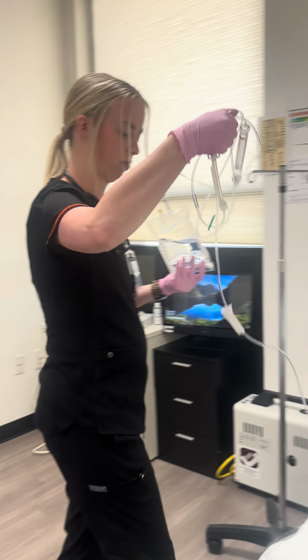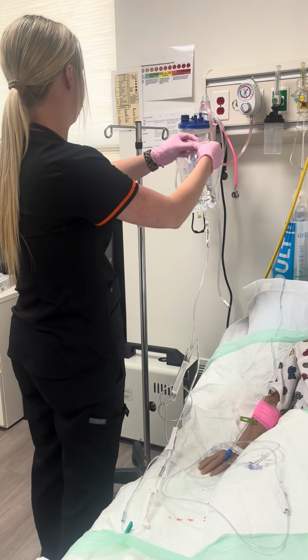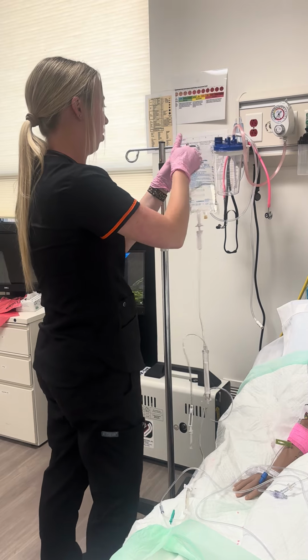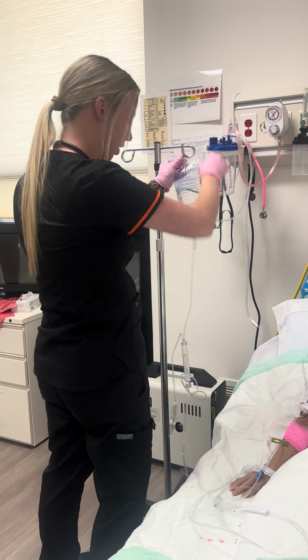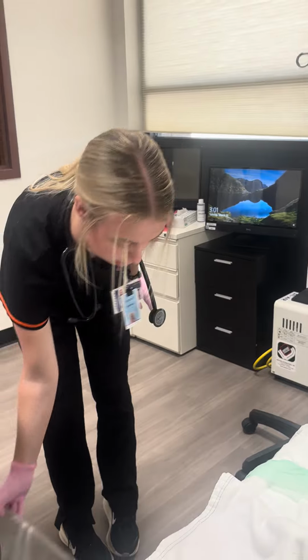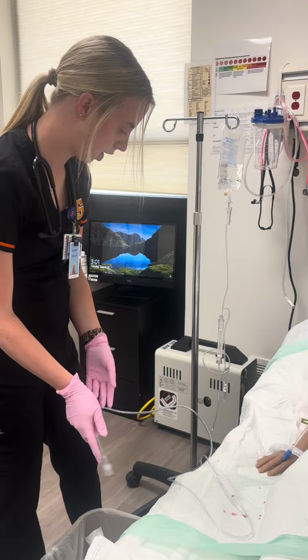And we'll bring this over. Okay, I'm going to bring a garbage over just to be able to pour it into. I don't want to have a mess today.